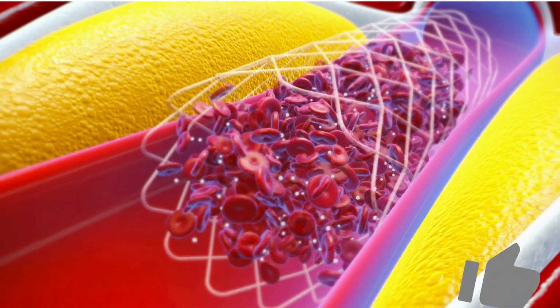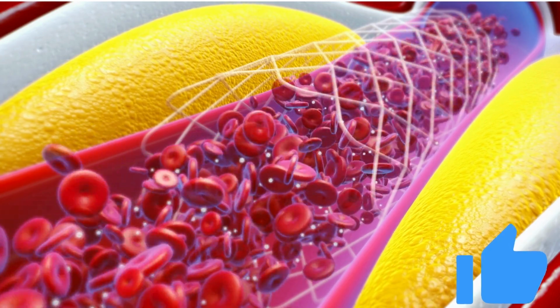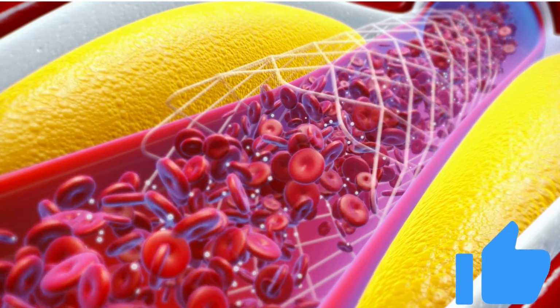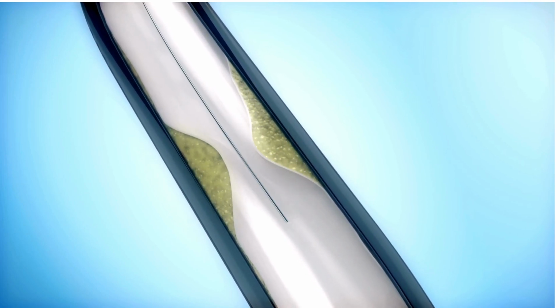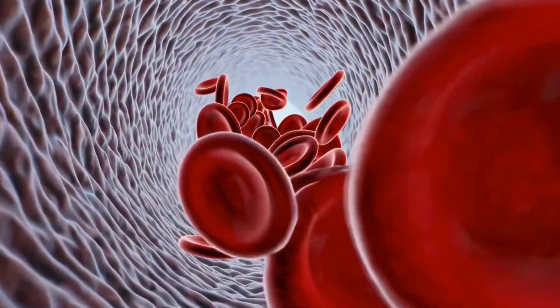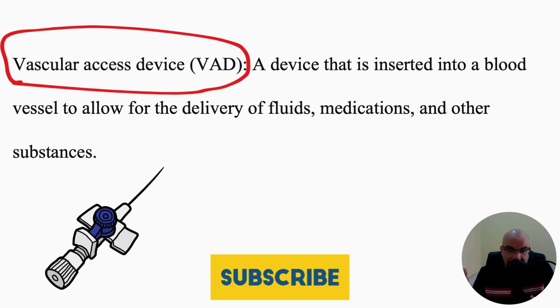However, there are some impacts or problems that can happen from these devices, such as infection, thrombus, and so on. So we are going now to clarify these things and discuss them from the infection control viewpoint. The definition of a vascular access device is a device that is inserted into blood vessels to allow the delivery of fluids, medication, and other substances as we described.